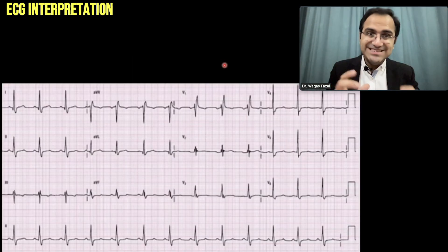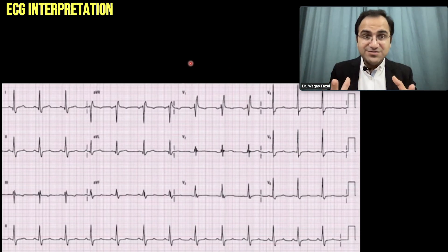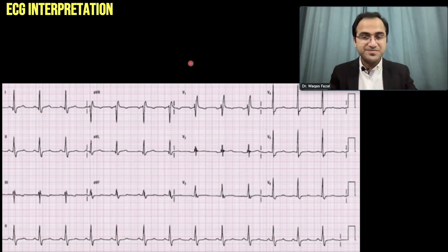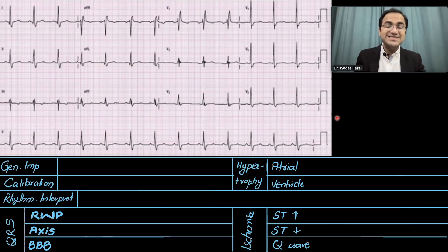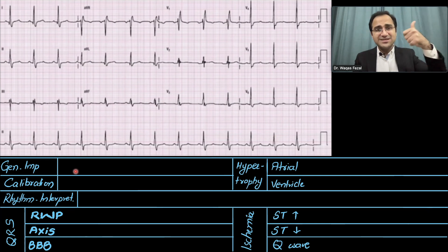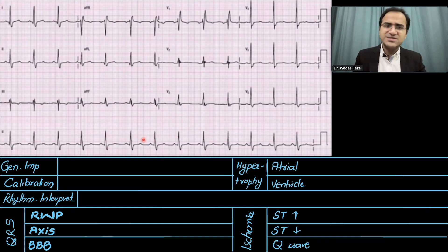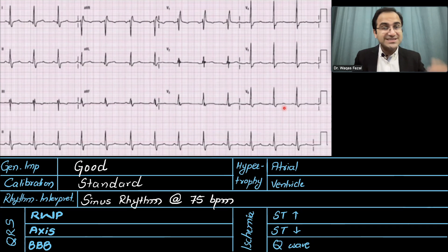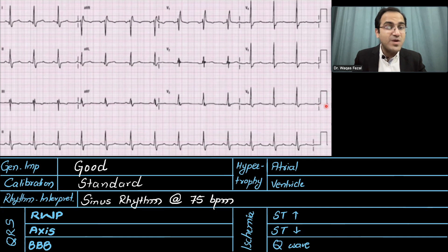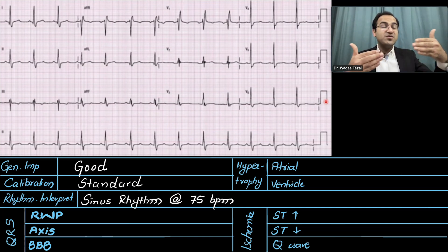Now we will solve some ECGs using the 6-step method. Look at this ECG — pause the video and find out whether right bundle branch block is present or not. In the 6-step method, the first step is to look at the general impression. The ECG is not very fast, not very slow, and not showing any ugly morphologies — so the general impression is good. The second step is calibration: the calibration box is one large box wide and two large boxes tall, which is standard calibration, meaning the ECG is printed at 25 mm per second.